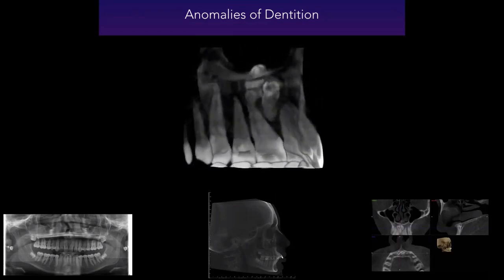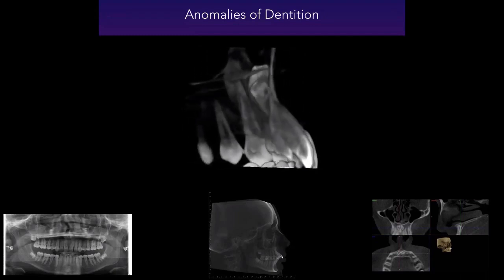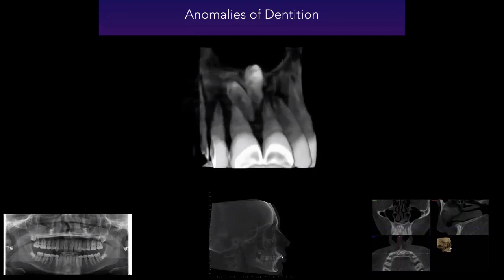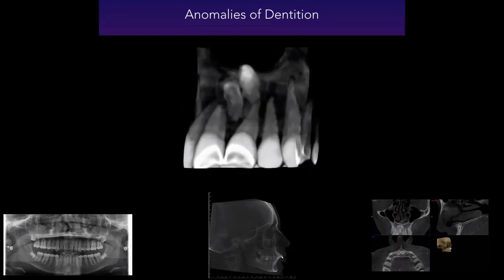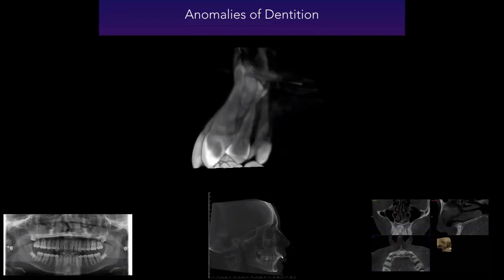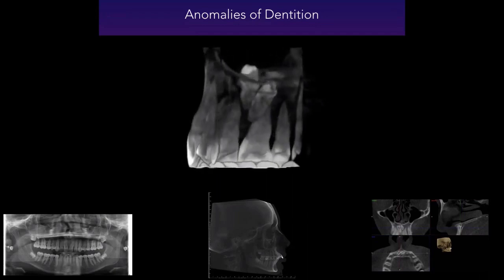And then when you try to explain that to a patient, they get it. It's not a pan where the extra teeth are outside of the trough and can't be seen. And now you've tried to upright those roots, but you couldn't upright the roots, and you're saying, why can't I? I'm in a heavy wire.